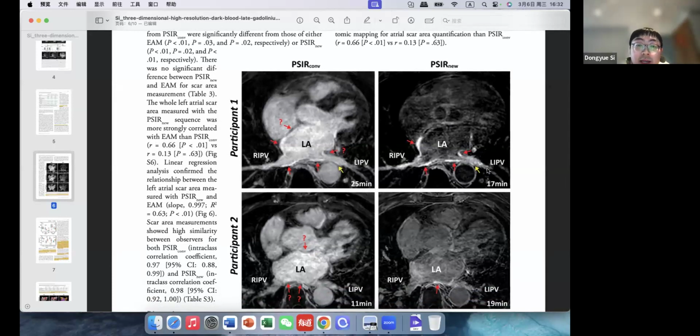Great. Related to that question, were the T2 prep pulses wideband pulses? This is from Dana Peters, who says the off resonance of the lungs might be affecting the T2 prep in the pulmonary vein blood and causing some of these artifacts. Yeah, I think so.